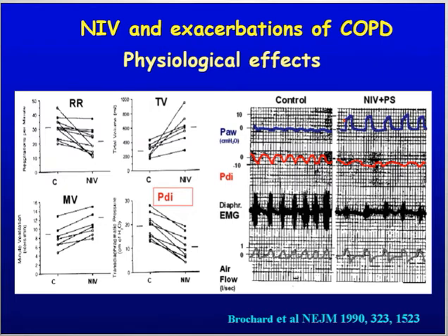By using a mode which synchronizes reasonably well with the patient, you can increase the tidal volume of the patient, in response to which the patient is going to decrease his inspiratory effort, and you see the significant decrease in transdiaphragmatic pressure, which is illustrated here by the decrease in diaphragm EMG. As a consequence, the patient can decrease his respiratory rate and improve the condition. And you can do that intermittently while the medications you have given will improve the patient.